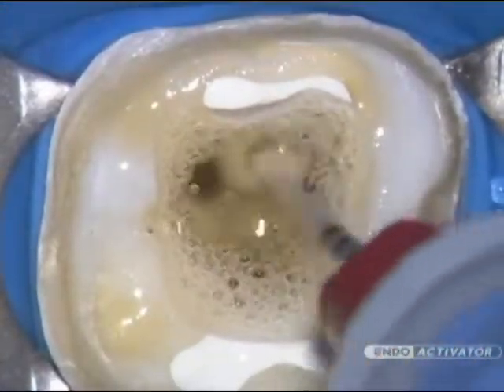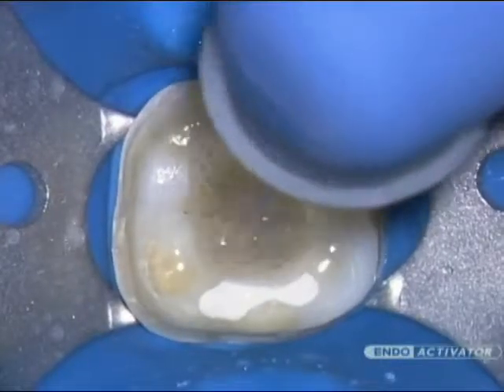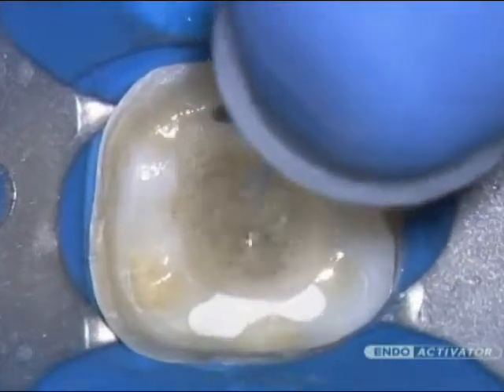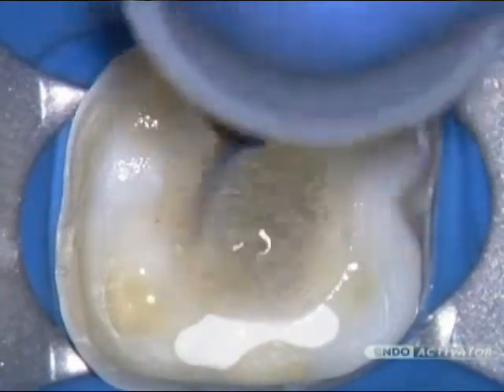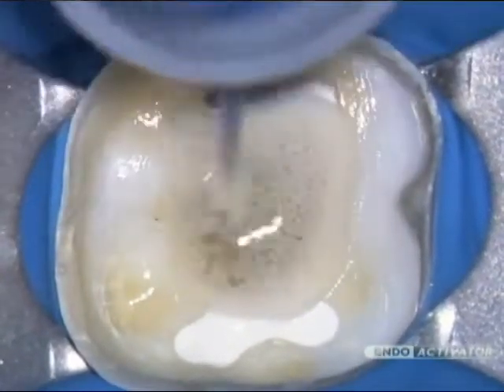Move the vibrating tip up and down in short 2 to 3 millimeter vertical strokes to optimize a powerful hydrodynamic phenomenon. In general, use 10,000 cycles per minute to encourage debridement and promote the disruption of the smear layer and biofilm.